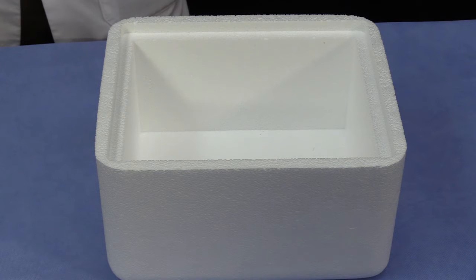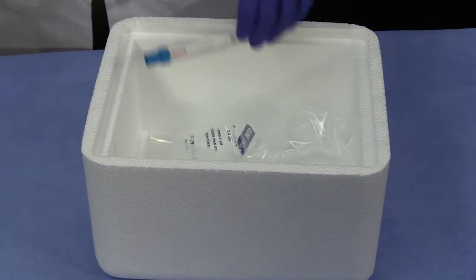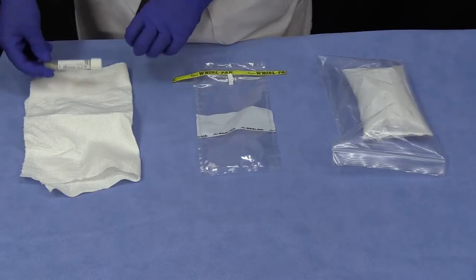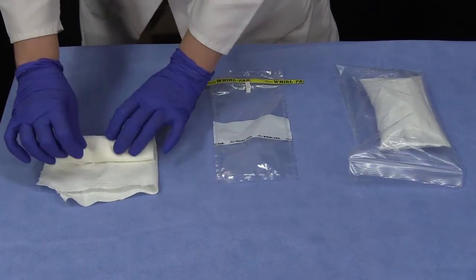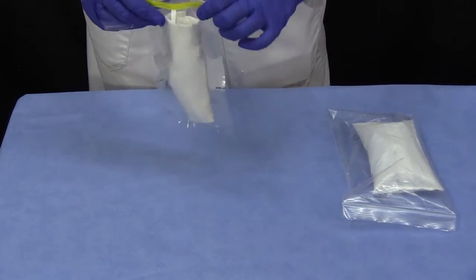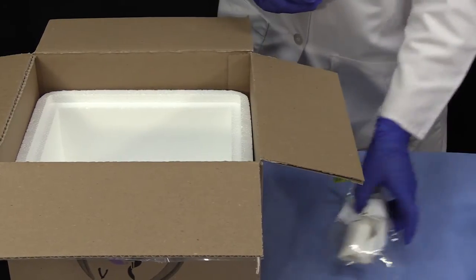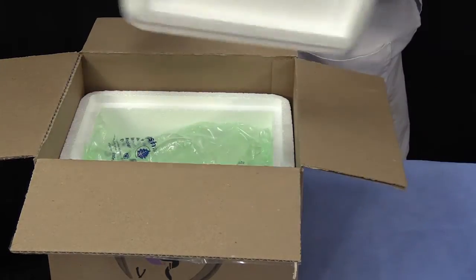It is a good idea to keep swabs cool prior to shipment. For example, if you will be collecting multiple swabs at one time, chill them immediately in a cooler with ice packs. Once you have collected all your swabs, wrap the containers of transport media in absorptive padding material and place it in a ziplock or whirlpack bag. Swabs should be shipped on ice packs for overnight delivery.